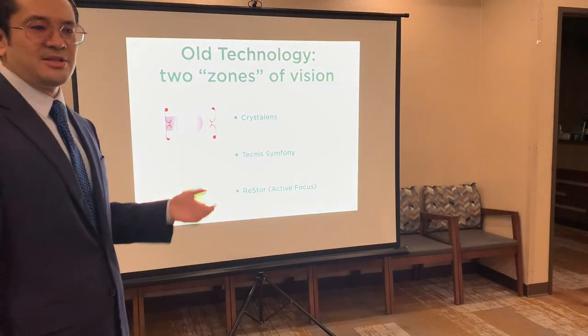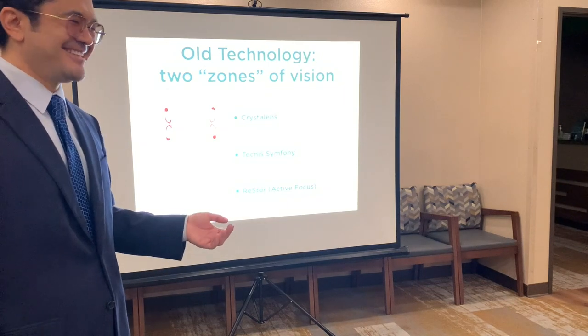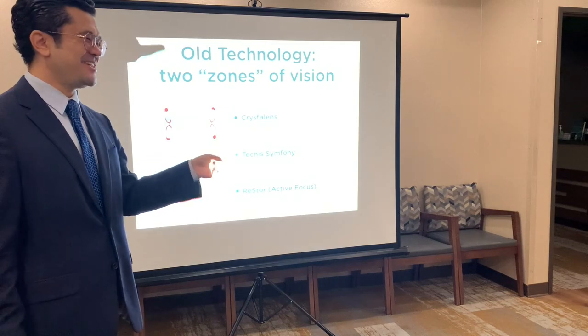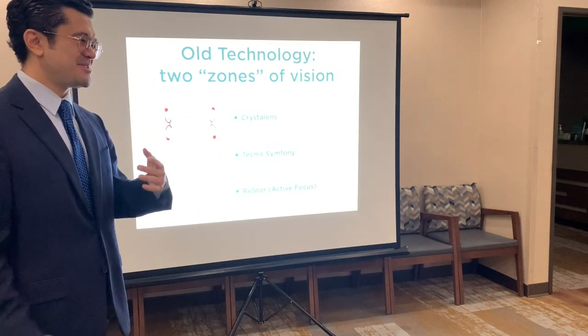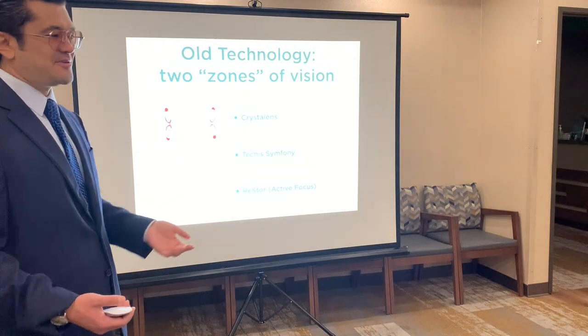You can see with every lens technology, there's a trade-off. So you can't have it all. I can see at night, I can see like an eagle, and I can see up close. You just can't do it all. So everything is a trade-off with every lens.